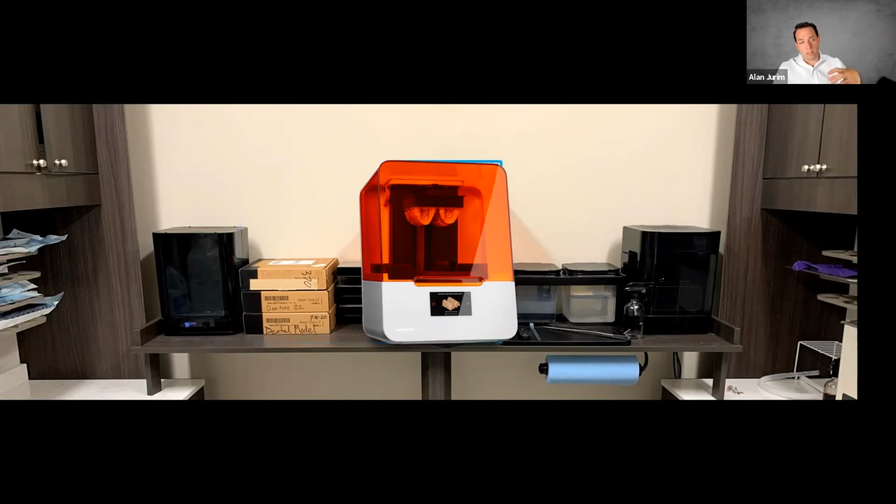Now, once a print is complete, the next thing that's going to happen is we take the build tray off, and then we put it into the alcohol baths. You'll see here we have 3 different alcohol baths: the dirtiest, the dirtier, and then the cleaner of the 3. We take the parts off the build tray, which is the part of the printer that I actually print on. We take the restorations off, whether it's a model, a splint, or a guide, and put them directly into the dirty alcohol bath. From there, we move to the next one, and then to the final one you see on the right, which is the really nice Formlabs automated alcohol bath wash.